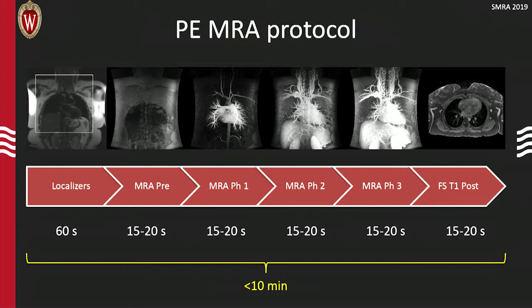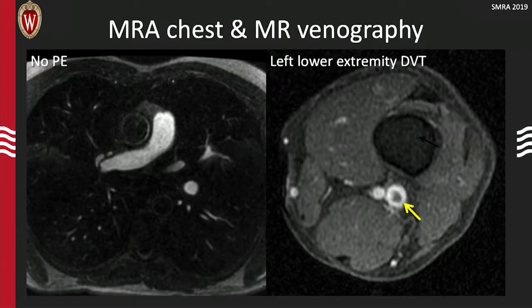And this can easily be done in less than 10 minutes. Usually it's done in less than 5 minutes. And this is really, really key, not only in terms of patient satisfaction, but getting acceptance for this protocol from non-imaging specialists. The ED physicians know that if they send us a patient, the patient is not going to be gone for 2 hours. They know that they're going to send the patient to MRI, and in 30 minutes the patient is back in the ED room, under observation.